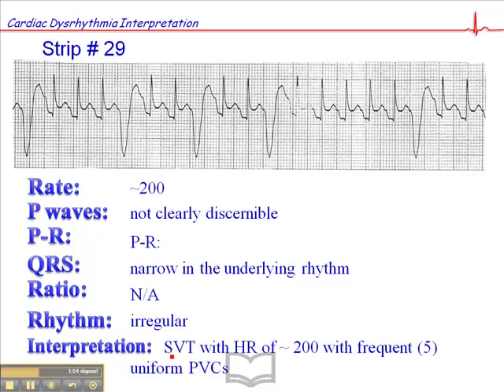The interpretation is supraventricular tachycardia — that's what this is — with a rate of approximately 200, with frequent uniform premature ventricular complexes. You'll notice that the QRS morphology is consistent: this one is the same as this one, same as that, same as this. We only have five PVCs in this rhythm, but you would want to report and document the number of PVCs per minute.